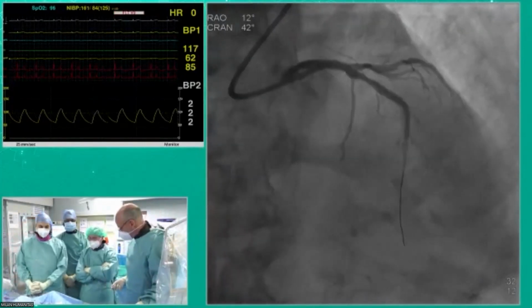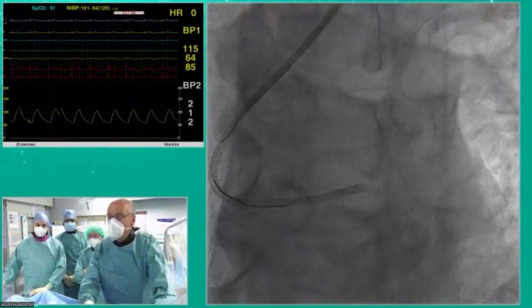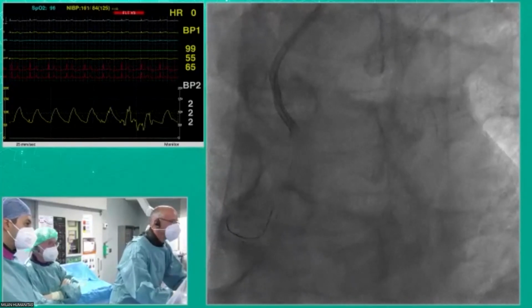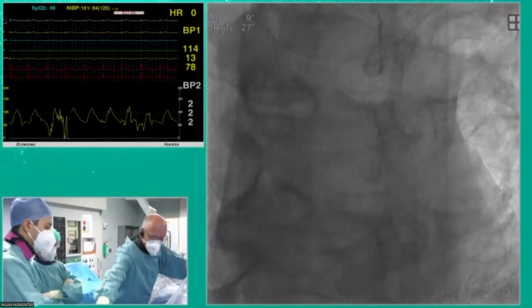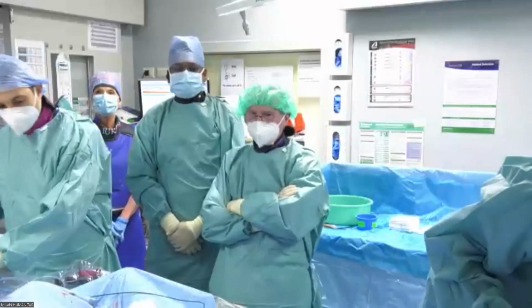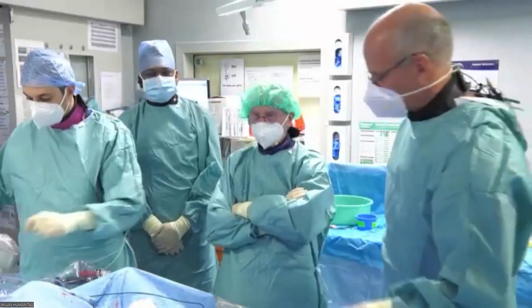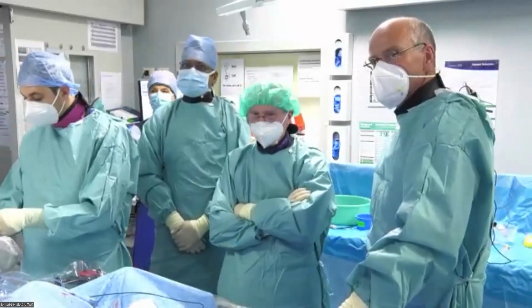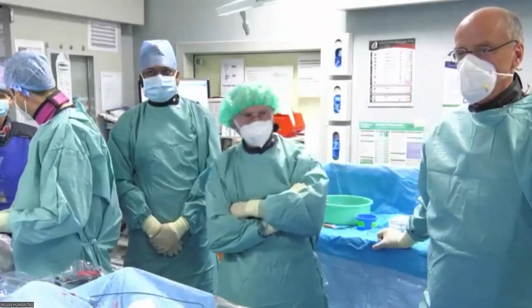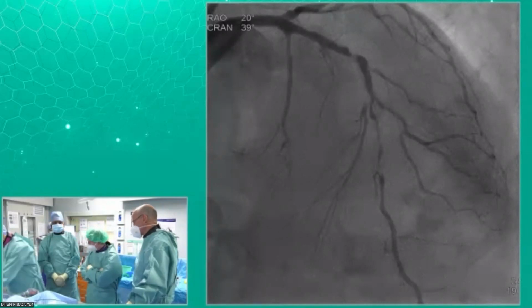Antonio, one last question for you. When there is residual dissection, are you routinely leaving the patient in the lab for another 10 minutes and waiting, or do you just? The only thing that I tend to do is to give ticagrelor or prasugrel for 2 weeks, and then you go down to Plavix. Got it. And so this patient was already on aspirin and Plavix, right? Yeah. He's 84 years old. The result is very good. Dissection is minimal. I'm not going to expose an 84-year-old to very aggressive antiplatelet therapy. I think clopidogrel is fine.